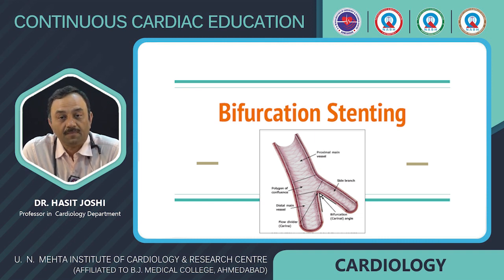Now, a side branch usually subtends a substantial myocardium, and hence the size of the side branch usually correlates with this. So any side branch more than 2 millimeter is considered a significant side branch.